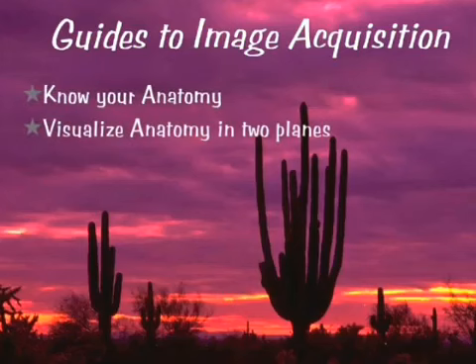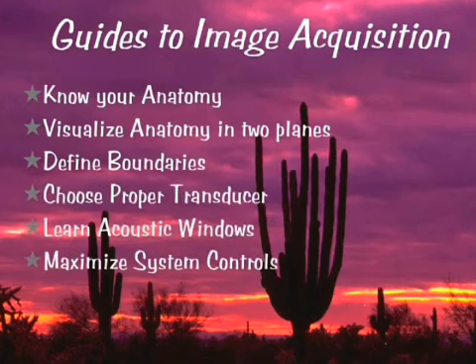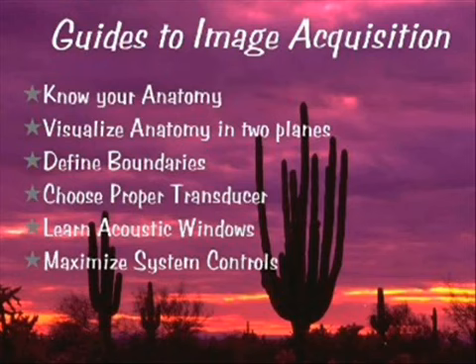Your guides to getting a good ultrasound image: know your anatomy, visualize the anatomy in at least two planes, define the boundaries, choose the proper transducer, learn the correct acoustic windows, and maximize the system controls for the best image.